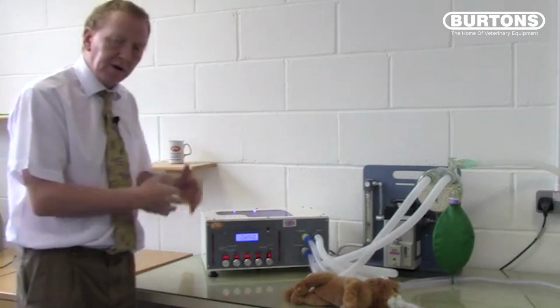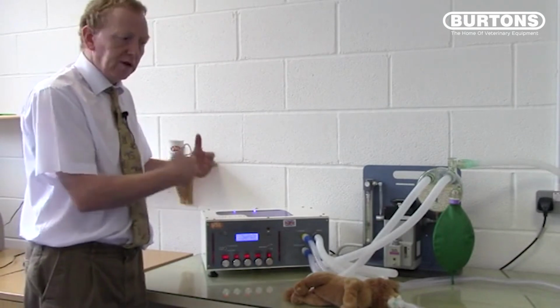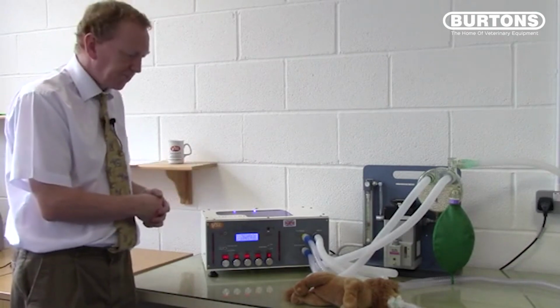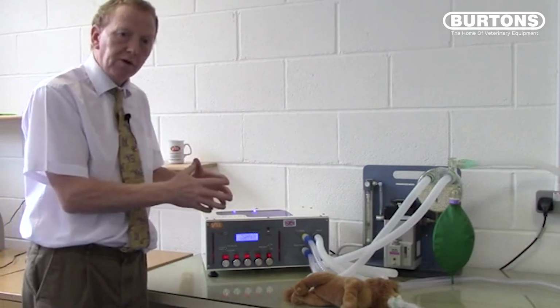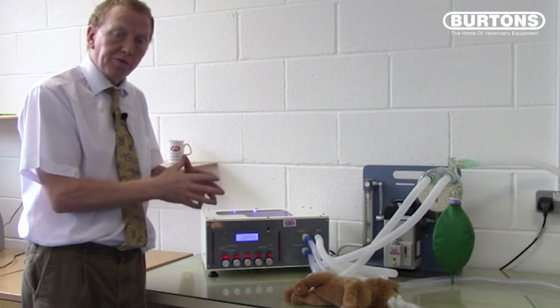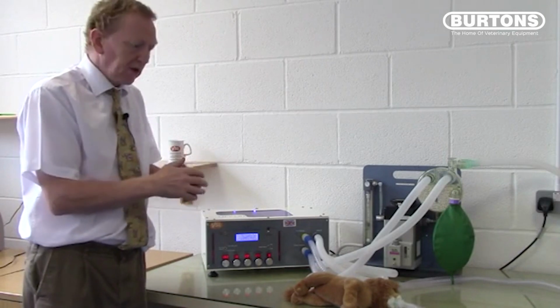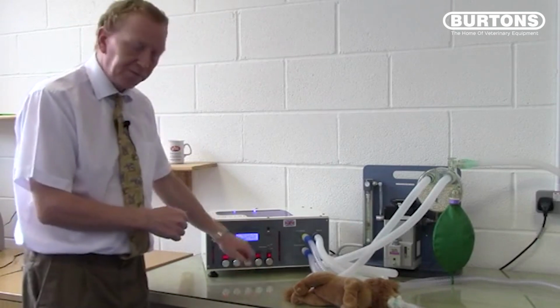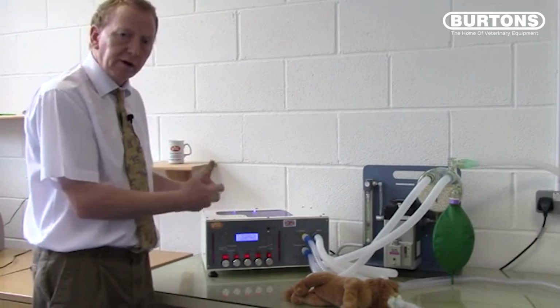So this is volume cycling mode. A preset volume is delivered. At the end of the volume, when the volume's all been delivered, the animal is allowed to breathe out and the process repeats. In volume cycling mode, the ventilator wants to deliver the whole volume. It really has no concept of the compliance of the animal or of the back pressure or of reaching a certain pressure. The only caveat to that is that our maximum working pressure is set at 25, and if for some reason the volume couldn't be delivered without rising above 25, an alarm will sound.